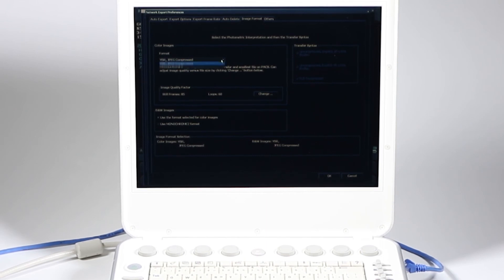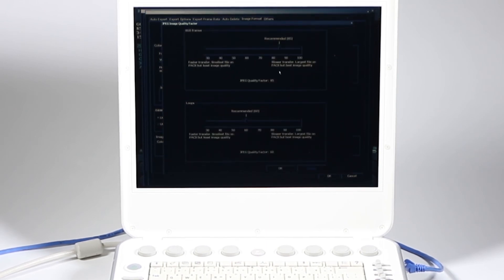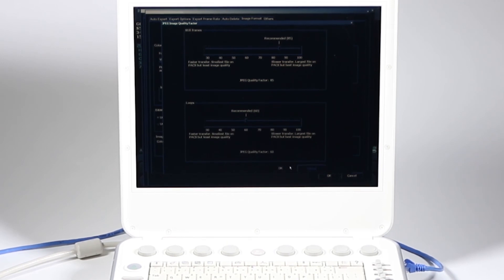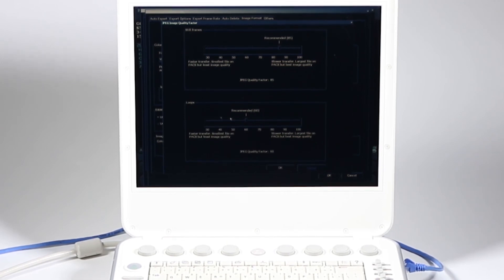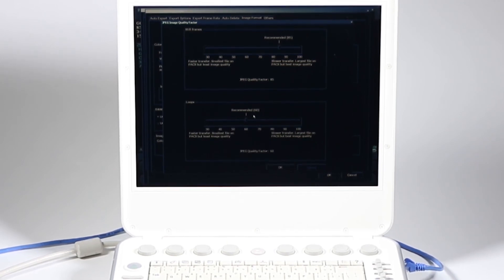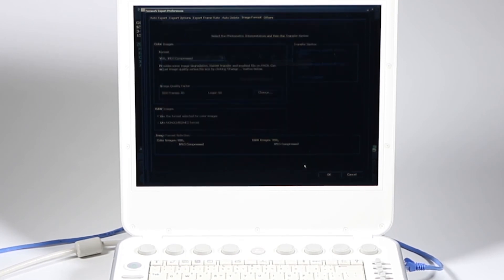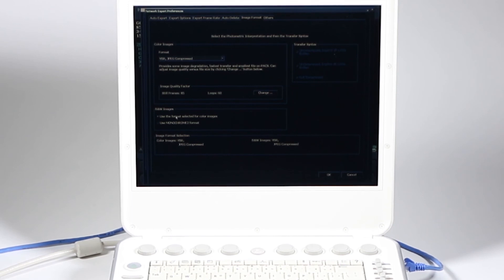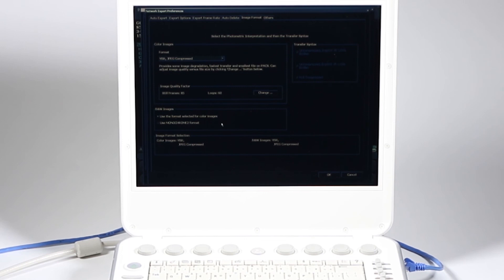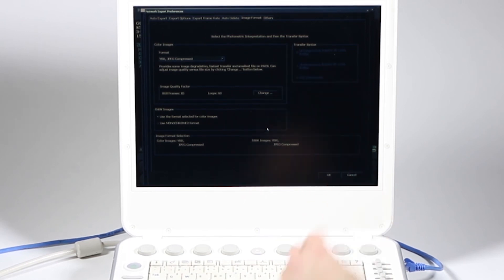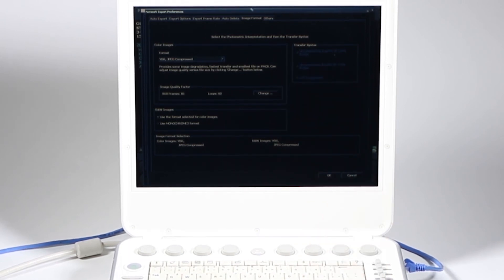My recommendation is JPEG compressed and then change, and these defaults are actually pretty good. So you're good to go with that. And here also on loops, if you want to have higher quality loops, you can move it up here. I'm going to go ahead and cancel there. And then black and white images, you can use monochrome too or format selected for color images, which is JPEG compressed. You can just leave that as is.